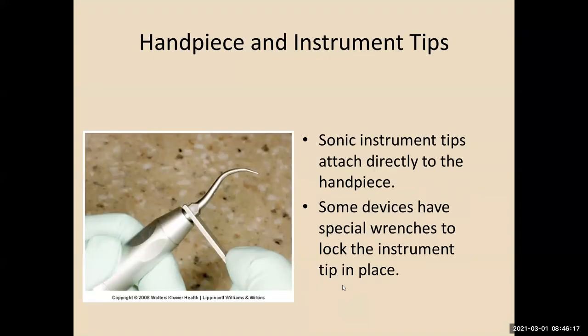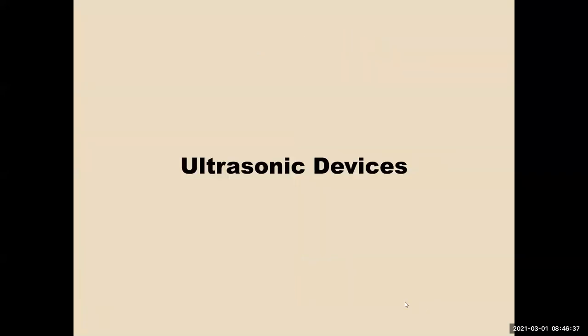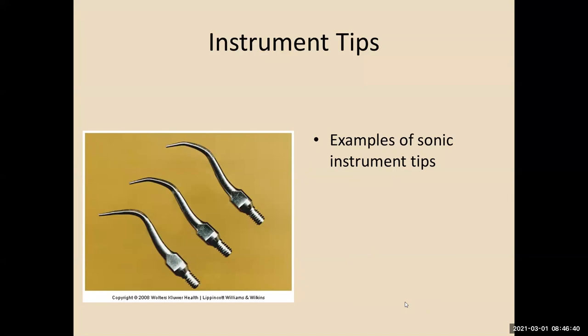So let's take a look at your sonic devices. You can see that you've got a wrench here, that you have tips, and then you've got your handpiece. Various tips. They're all pretty thick. Sonic does not need water. And it just literally fractures the calculus and it makes horrible, horrible noise.